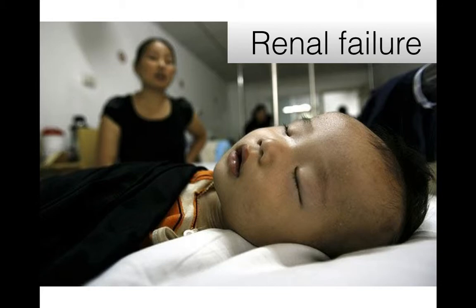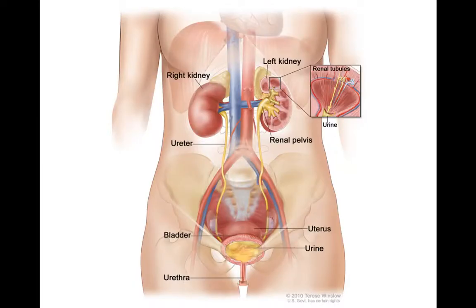For the intrinsic, you should look at the detail of the cortex and the medulla and the relationship between them, and even use Doppler. That's kind of comprehensive scanning. I think that does not belong to our initial experience. So for the post-renal cause, it will be easier and has immediate impact for those kinds of emergencies.